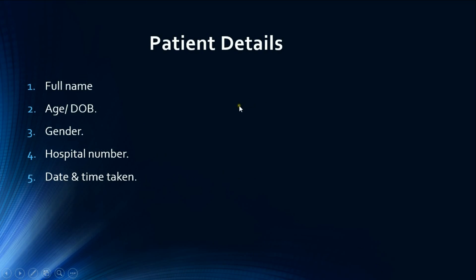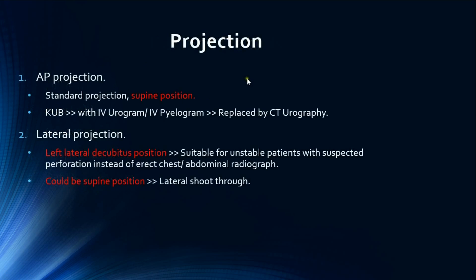Step one is patient details: full name, age, gender, hospital number, date, and time the radiograph was taken. The next step is to check the projection of the abdominal radiograph.